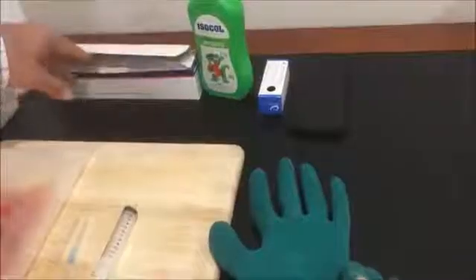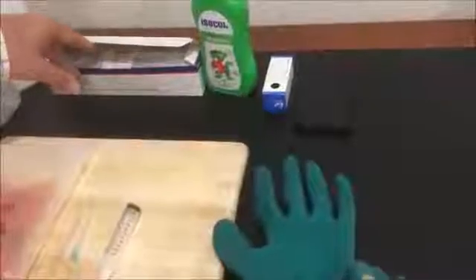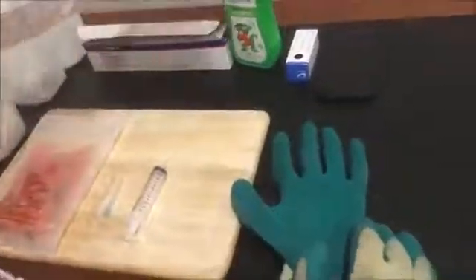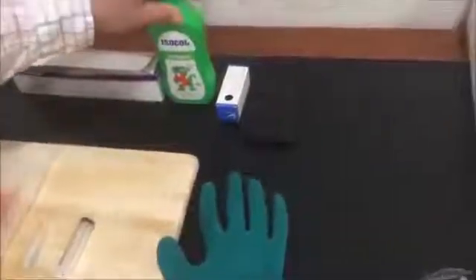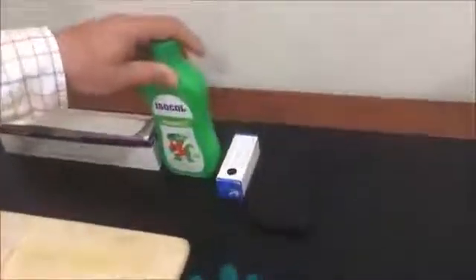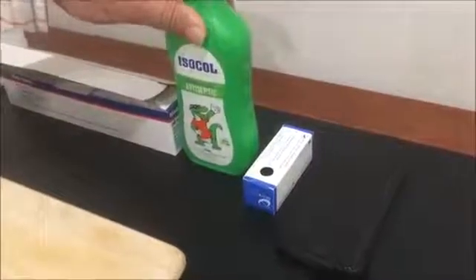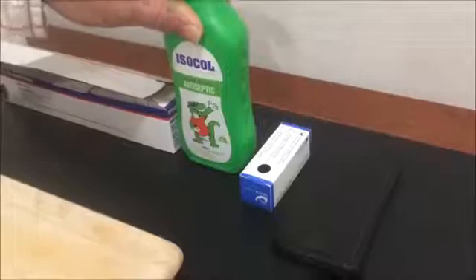We have alcohol swabs here for cleaning the ports before injection. Alcohol can also be used for disinfecting. The beauty of alcohol is that once it's evaporated there's no residue, as opposed to detergents and other disinfectants.